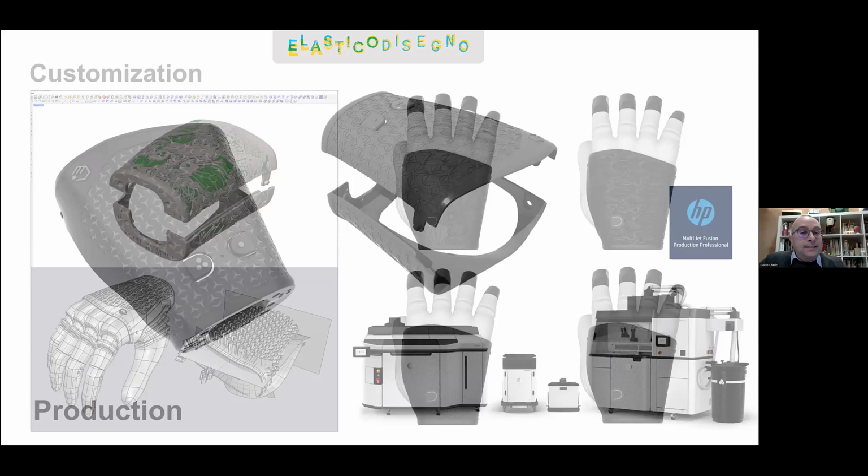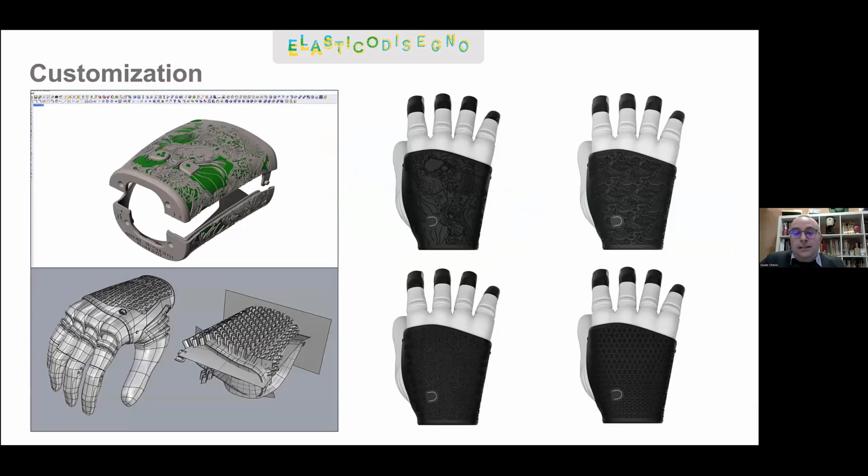And so the customization that we were thinking of, which was mainly in the replaceable covers, was made using engraved patterns. So back from Creo back into Rhino, we started developing many different patterns for the covers. Some geometric ones, some more organic. So we have many different patterns that were embossed in the surface of the covers.